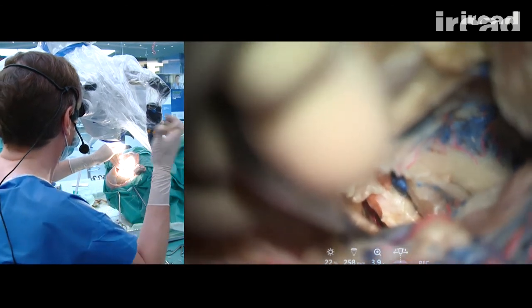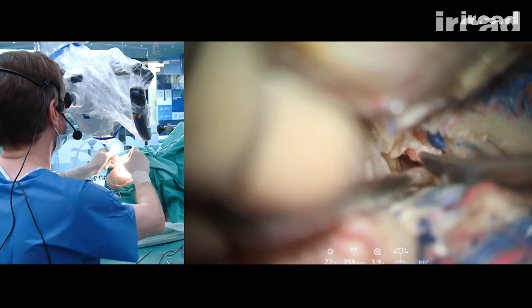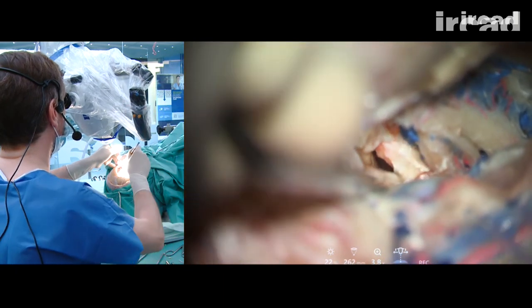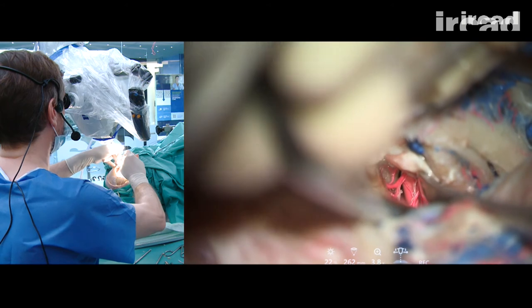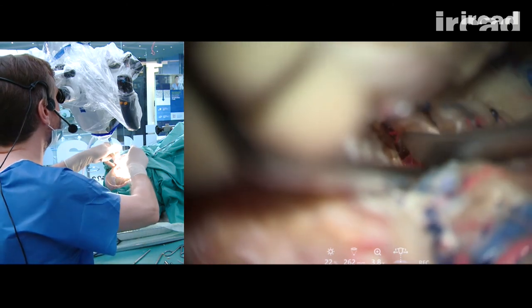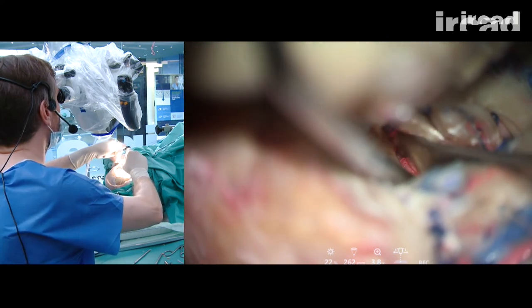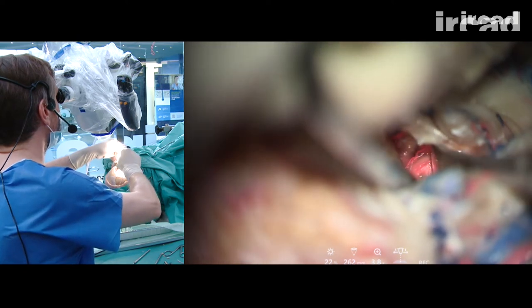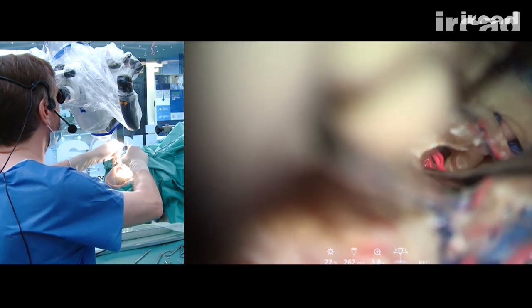And deep here is a stalk. Pituitary stalk seen between carotid artery and the optic nerve. This is the stalk. And this is, I guess, PCOM here. And I can see the basilar very deep here. I don't have much space, but this is basilar artery. Superior hypophyseal artery here. And this is PCA and PCOM, and here are the perforators. On the other side here, perforators, PCA. This is probably anterior choroidal.